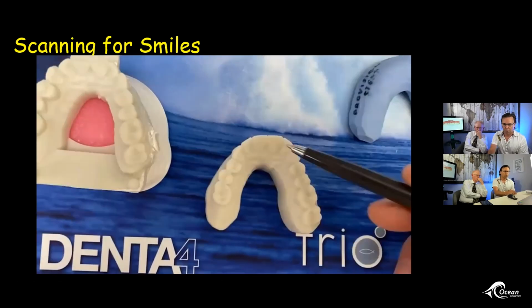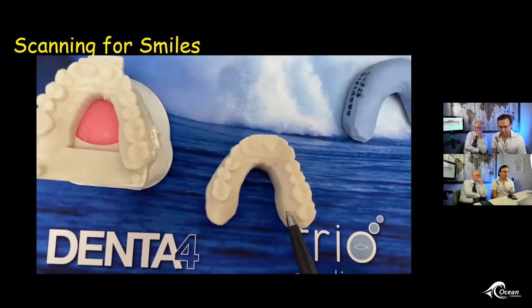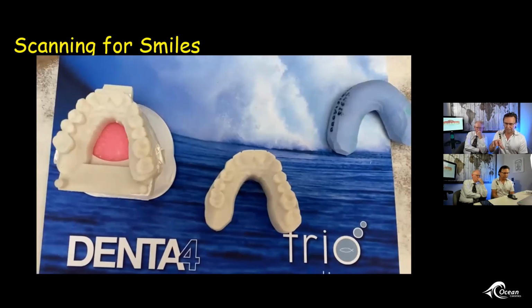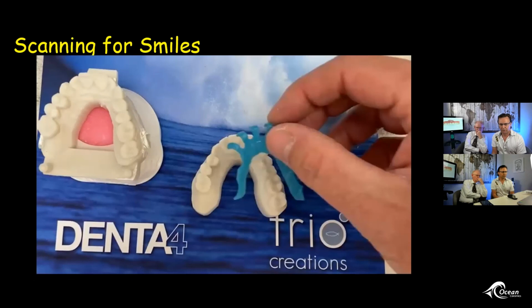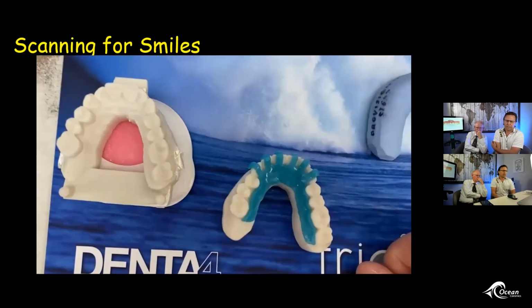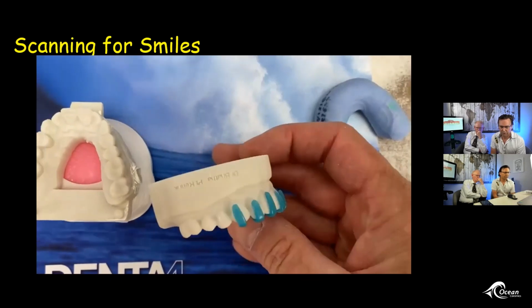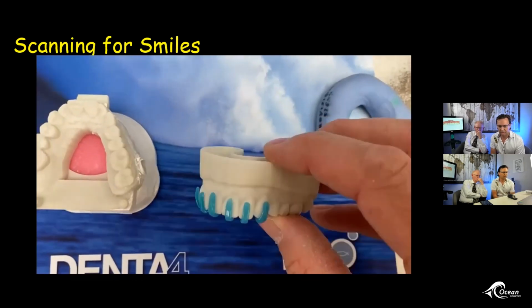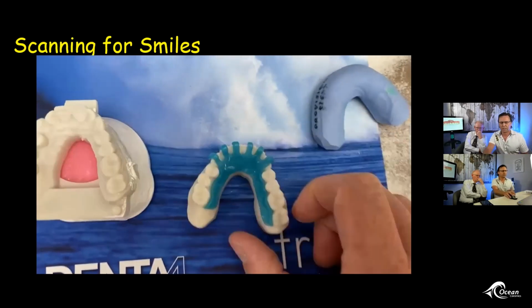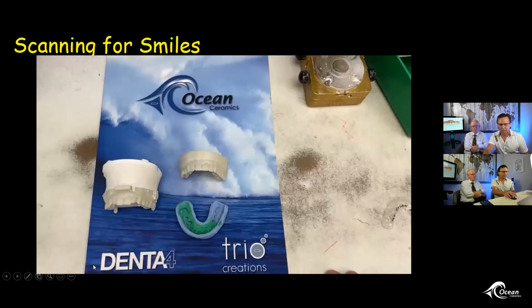So on a lower, you want to make sure you get all those retromolar pad areas as much as you can, so that we have positive stops for a waxed up tray to seat. And that was the purpose of this video we put out there. There's a neat little reduction guide that we printed off on the next end, because nice little design. We just thought we'd try something new. This was Dr. San Batha's case in South Surrey. I never did hear how that case went, but it's finished. So anyhow, that was a really good trick there. Always scan the palate, folks.